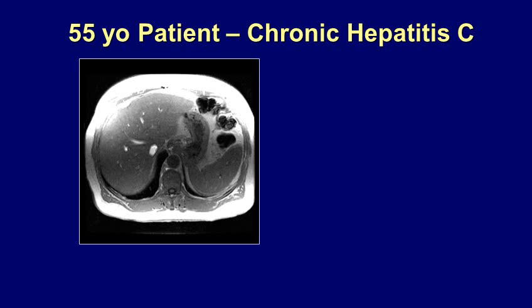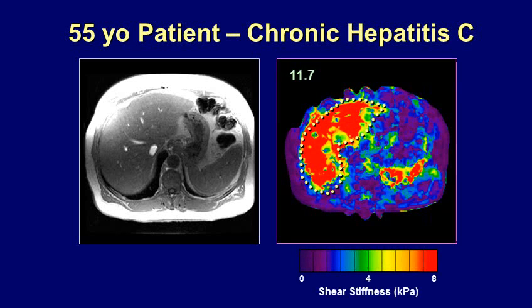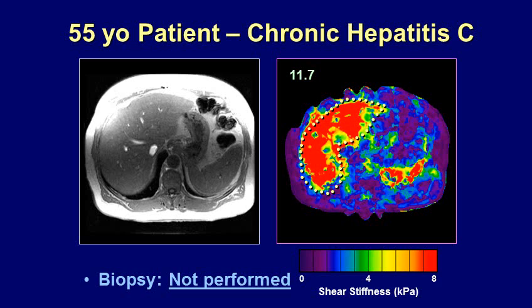In the past, a biopsy was needed to make that determination. Now we have an alternative, and in this patient, MRE revealed an unexpectedly advanced disease. This patient went on to have treatment without having to have a liver biopsy.